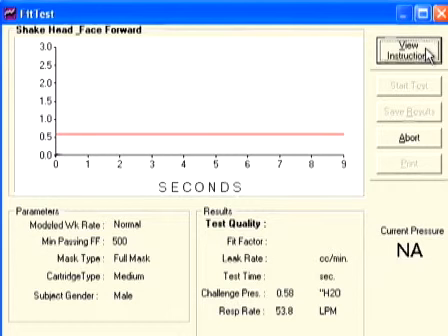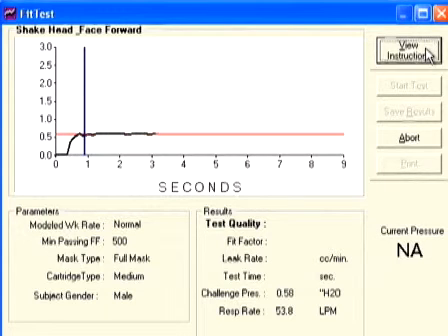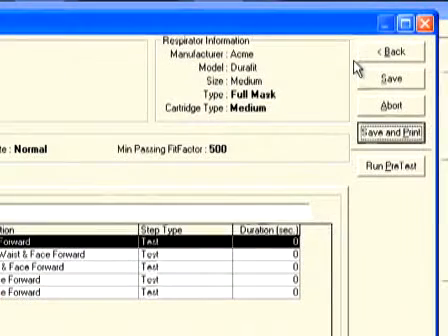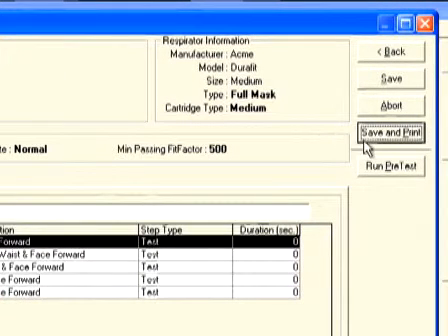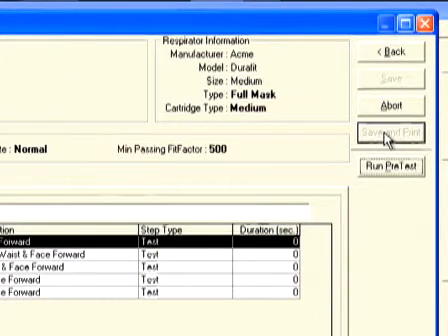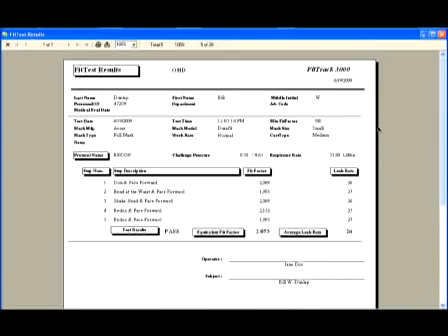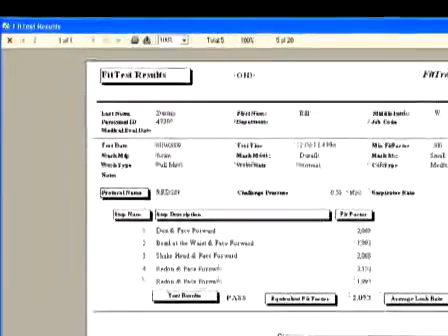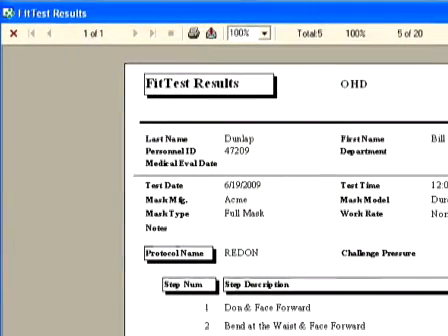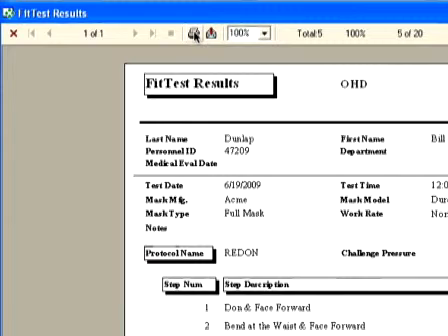All data and information will be saved to the database. After the protocol is finished, you will be prompted to save and print the test. If print to window is checked under the system menu, the test will first print the results to your computer screen. At that time, you can click on the print icon in the window bar to send to the printer. If print to window is not checked, the test will automatically go to the printer.